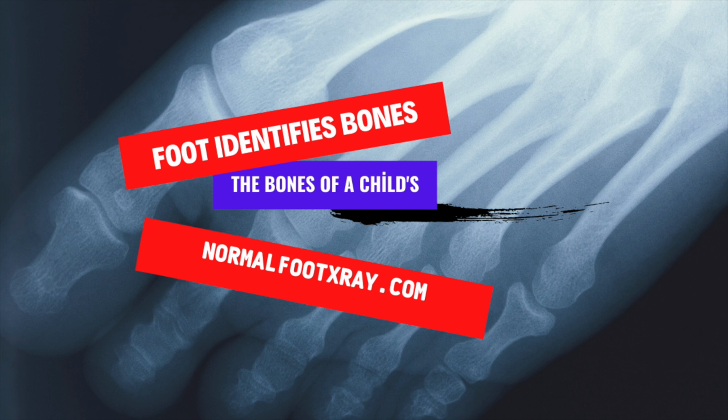It can also detect fractures and dislocated joints. It can also assess the healing of bones and ensure proper alignment. Moreover, a foot X-ray is useful in planning and assessing surgical procedures. It can also detect cancers and later stage infections of the bones. These types of X-rays are essential in diagnosing certain types of disorders.